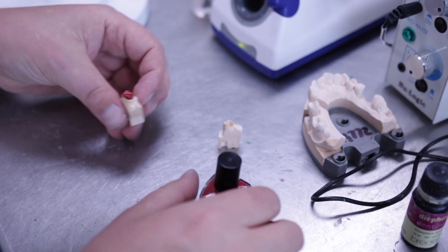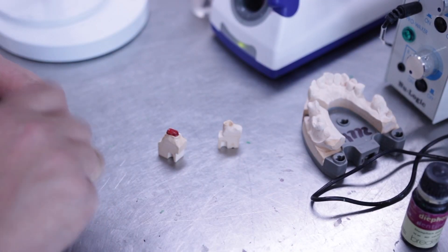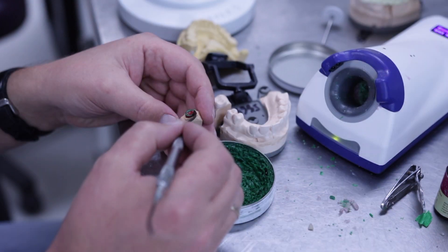Next, apply a thin layer of a coloured spacer, approximately one millimetre from the cervical margin.